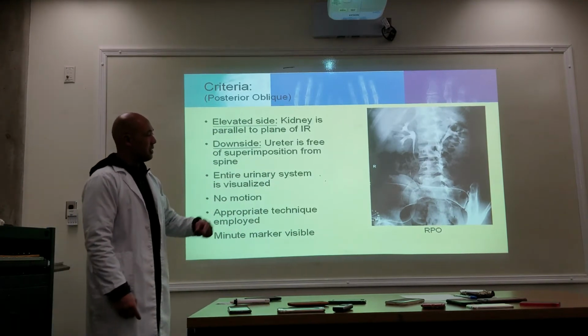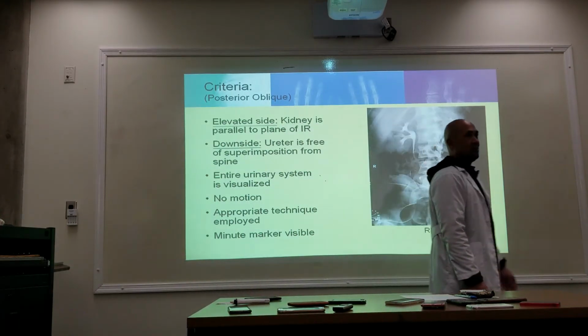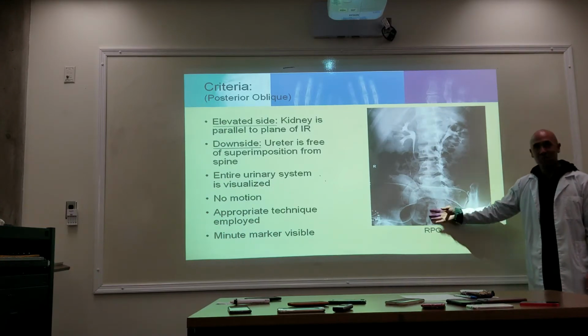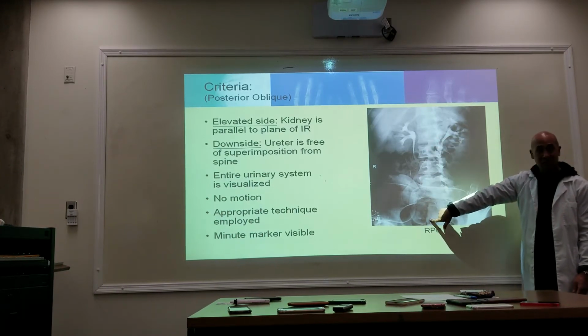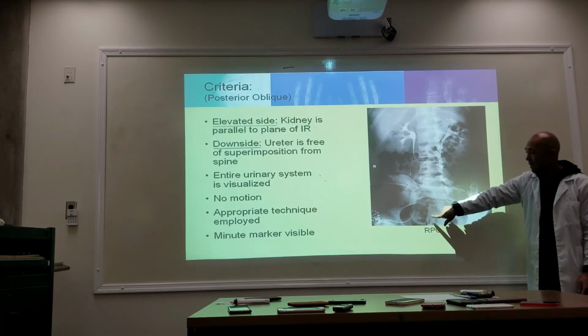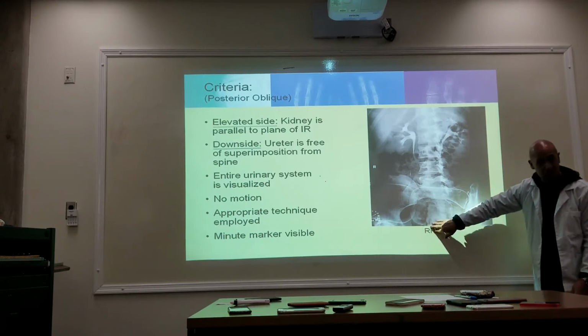Now if I'm looking at this, why did we cut off the bladder? Does it matter? In this picture it doesn't matter because they have the compression paddles. Where's all the contrast? It's up here. There's not going to be any contrast down here because of the compression paddle. But in any other case, you want to make sure that you see the symphysis pubis.